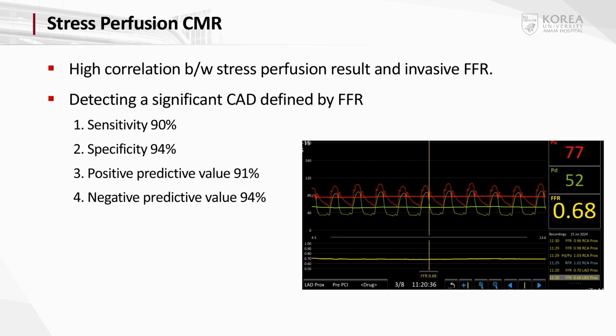However, several studies comparing stress perfusion CMR show excellent performance in the diagnosis of hemodynamically significant coronary artery disease, confirmed by invasive testing.